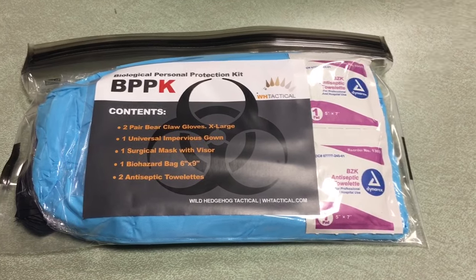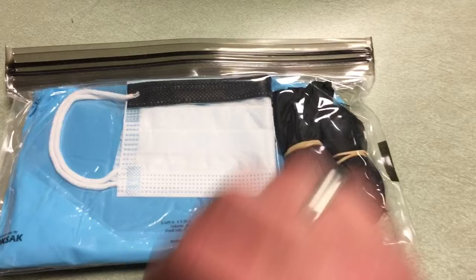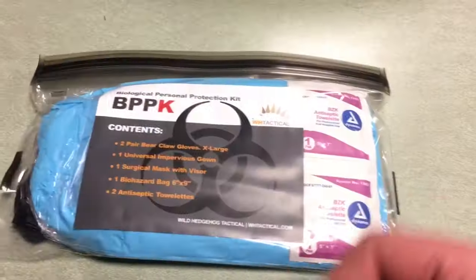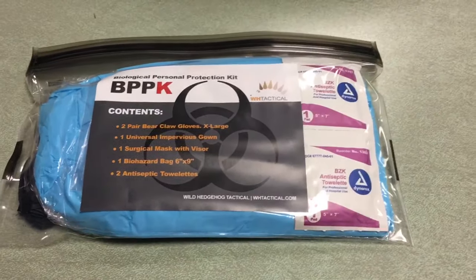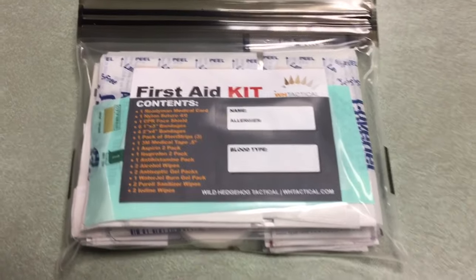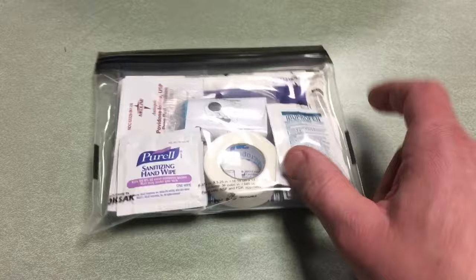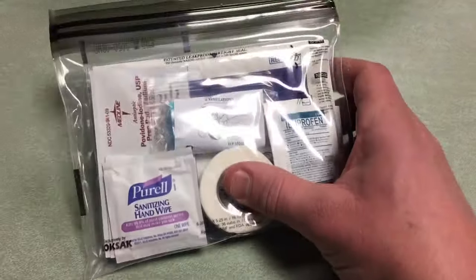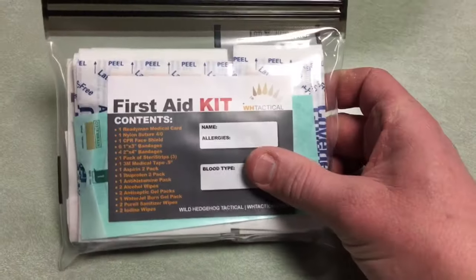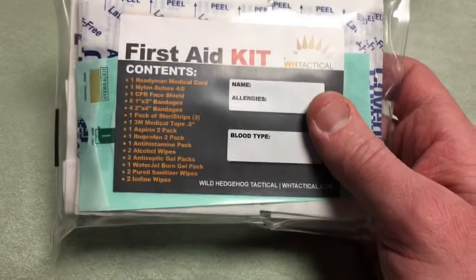Next up is a biological personal protection kit — so gloves, a gown, a visor, a bag, and some antiseptic towelettes. This is to keep nasty stuff off your person. This is one you're probably going to use the most. Hopefully you're not going to have to use a lot of the other stuff, but this is your basic first aid kit. Flipping it over, you can see ibuprofen and a small thing of medical tape, plus a bunch of basic band-aid type things.